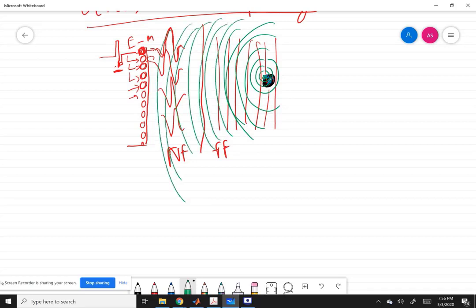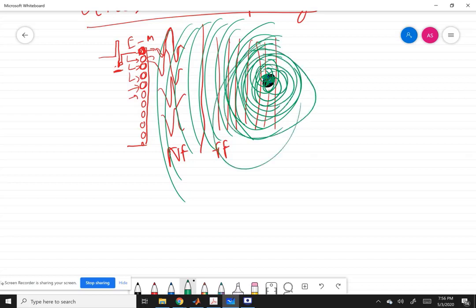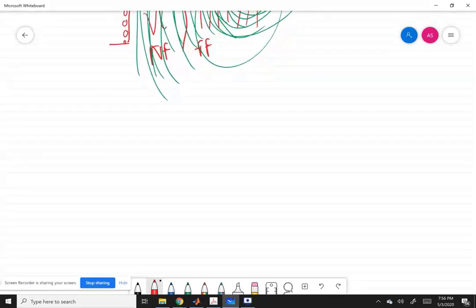Every point on this object becomes a spherical radiator, depending on the intensity which hits it. So each of these transducers will receive the sound waves radiated from each of the points on this object.